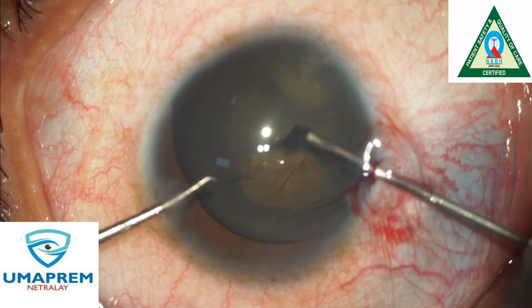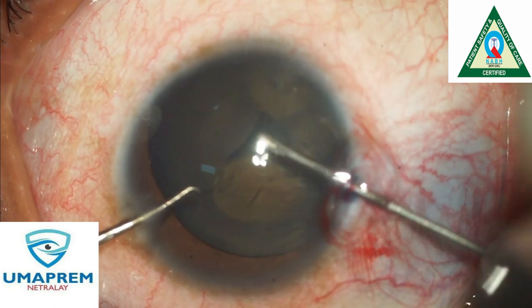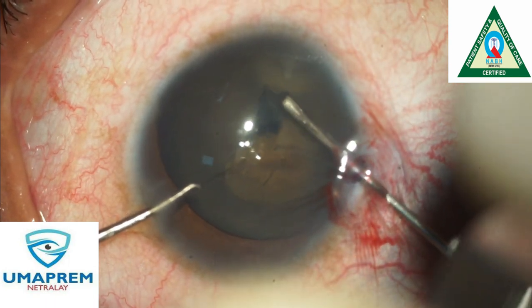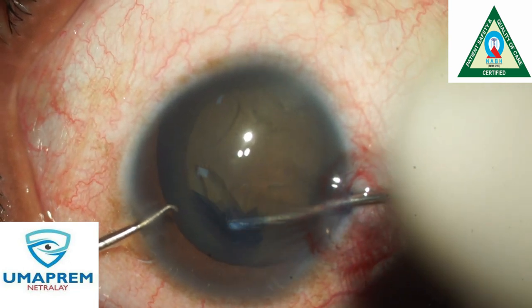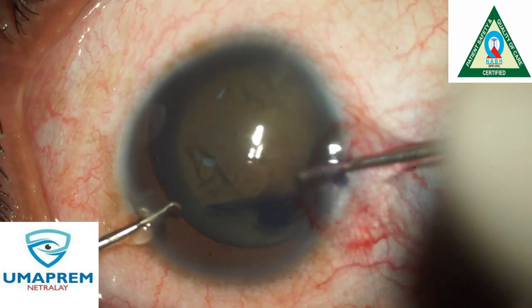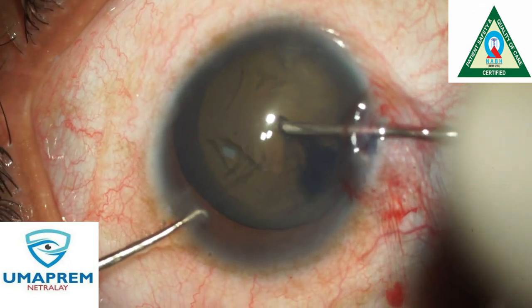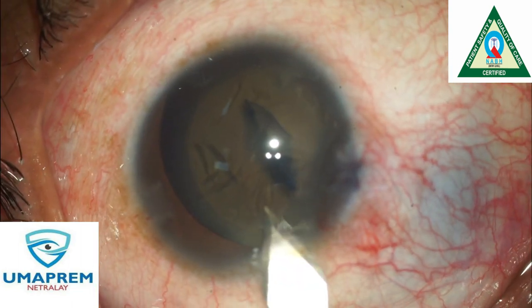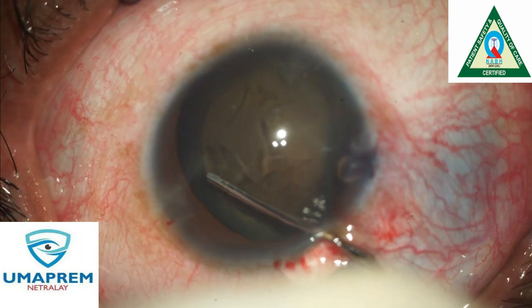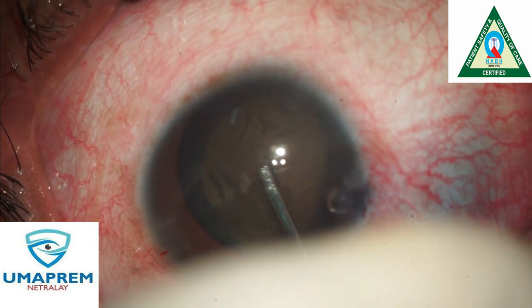We start with a bigger rhexis because this nucleus is very bulky and very hard. We generally make a 6 mm rhexis, which is slightly larger than the normal rhexis, because this type of eye has very high chances of complication and very loose zonules.